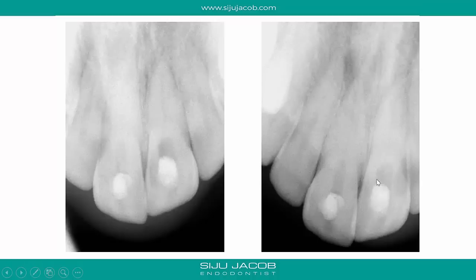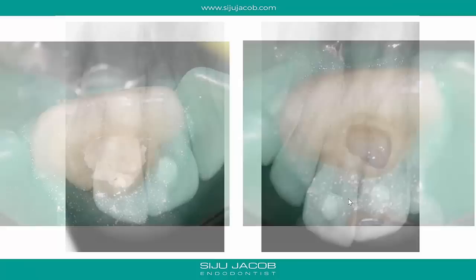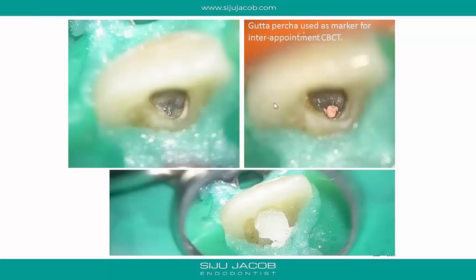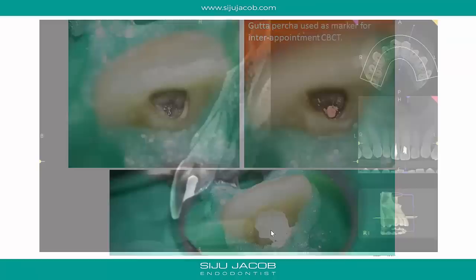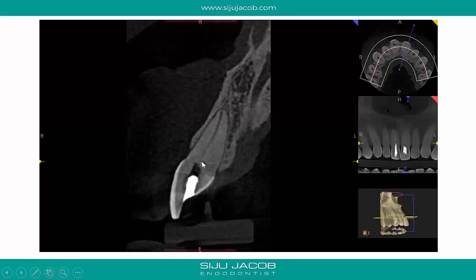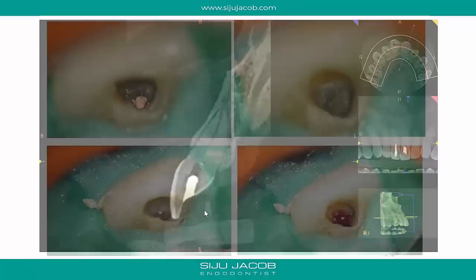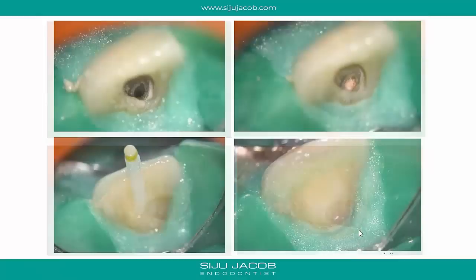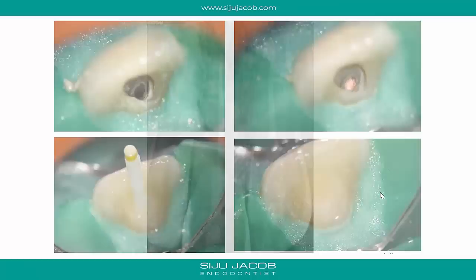Here's another case where you can see trace of a canal but not clearly. As I went deeper I wasn't really sure where to drill, so I placed a blob of gutta-percha where I was drilling in the coronal part, closed it with a temporary filling, and took an inter-appointment CBCT. The CBCT told me the canal was labial to where I was drilling. You can see the blob of gutta-percha and the canal's actual location. With that information I knew to look labial to my previous position — and sure enough that's where I found the canal. Once found, I cleaned, shaped, and placed a post as well.